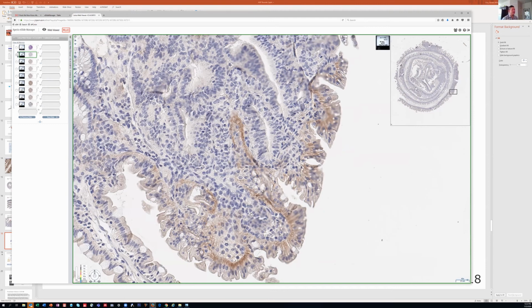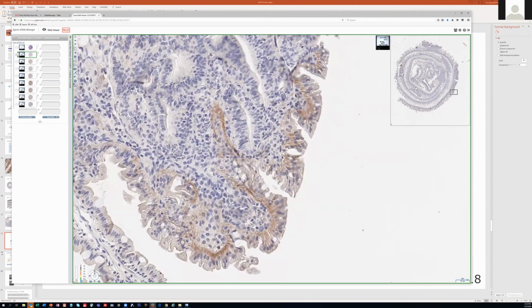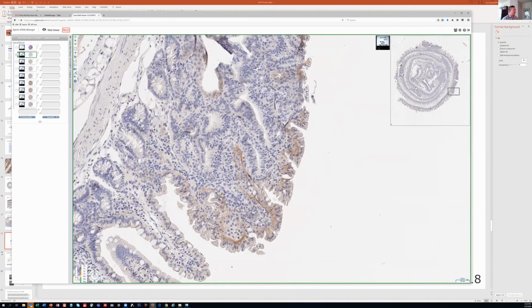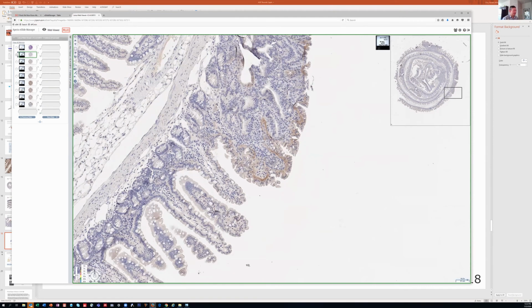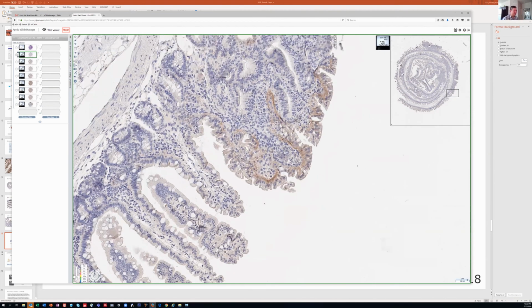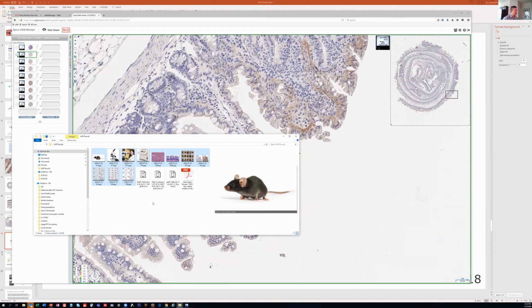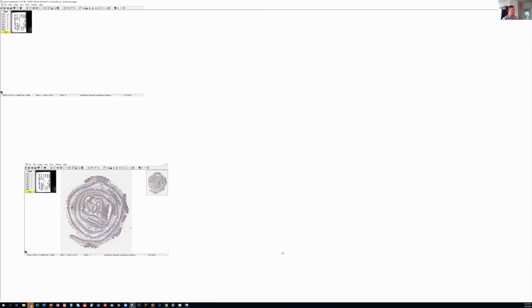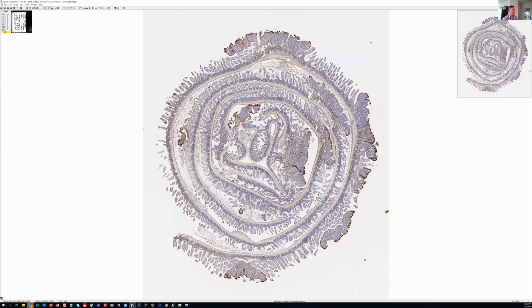But I now have this observation whereby activation of the EGFR pathway is not in neoplastic epithelium, but in the hyperplastic, non-neoplastic epithelium overlying the adenoma, and not in normal villi as well. So let me just show you the total EGFR one to clearly show this is the case.